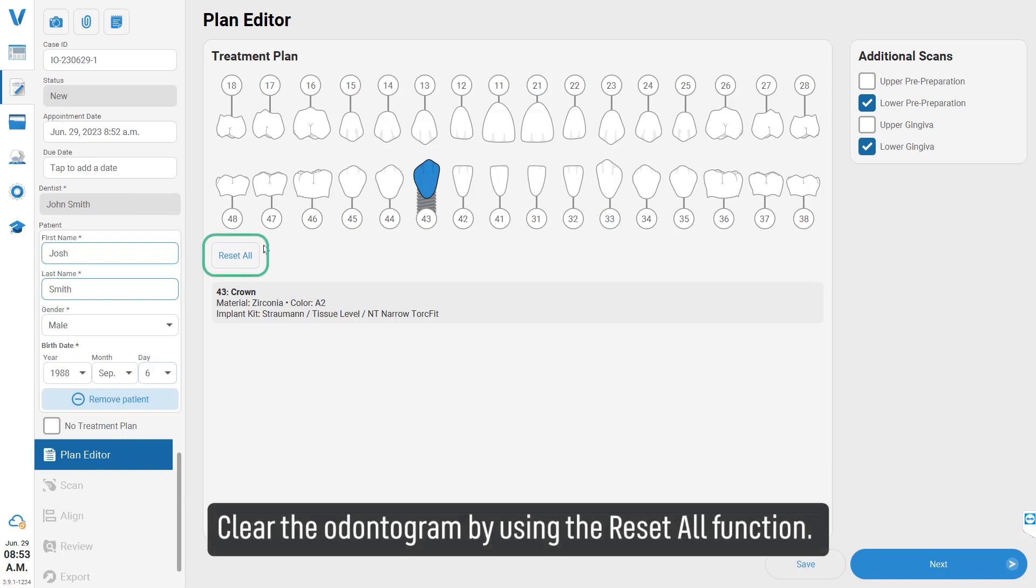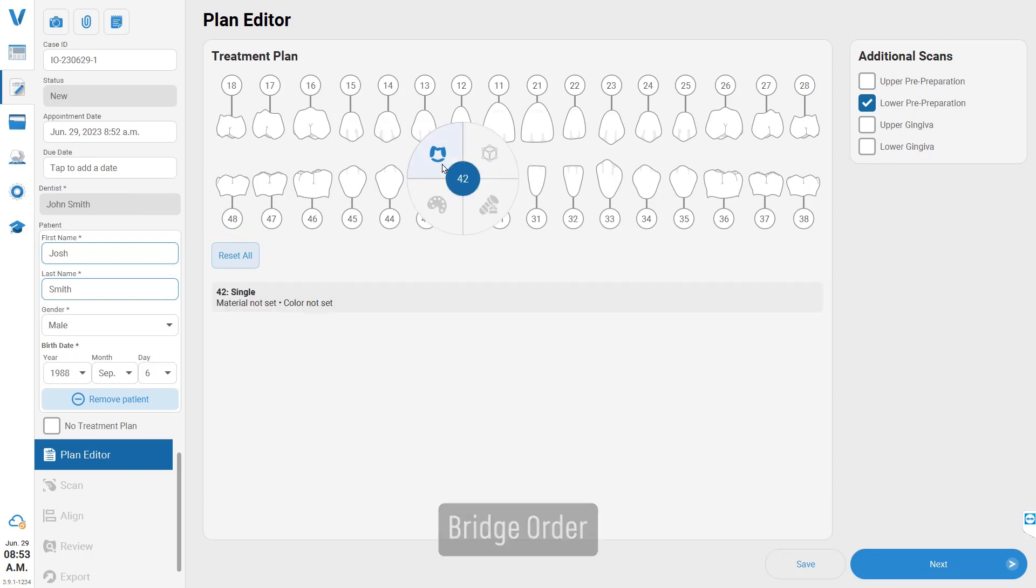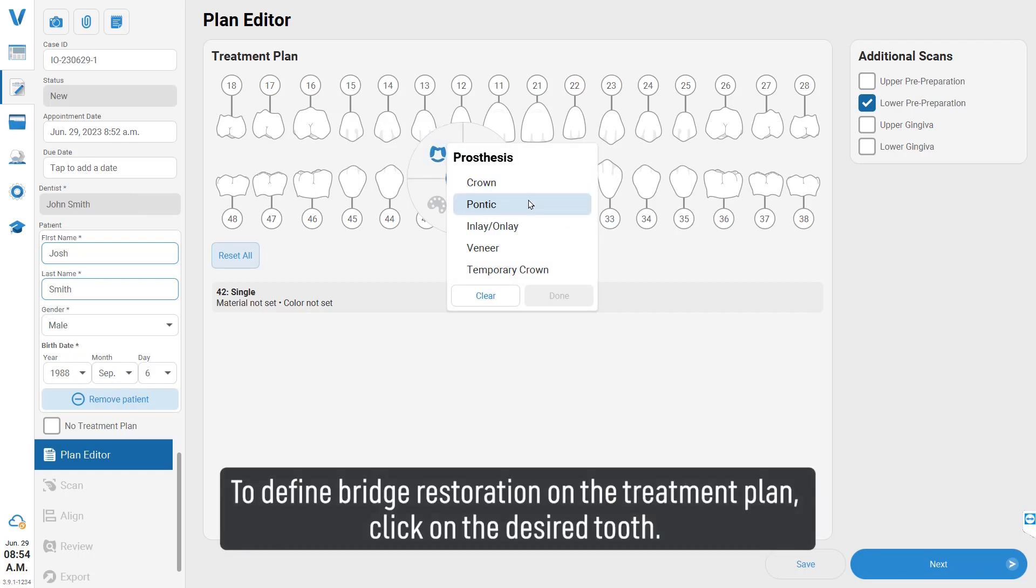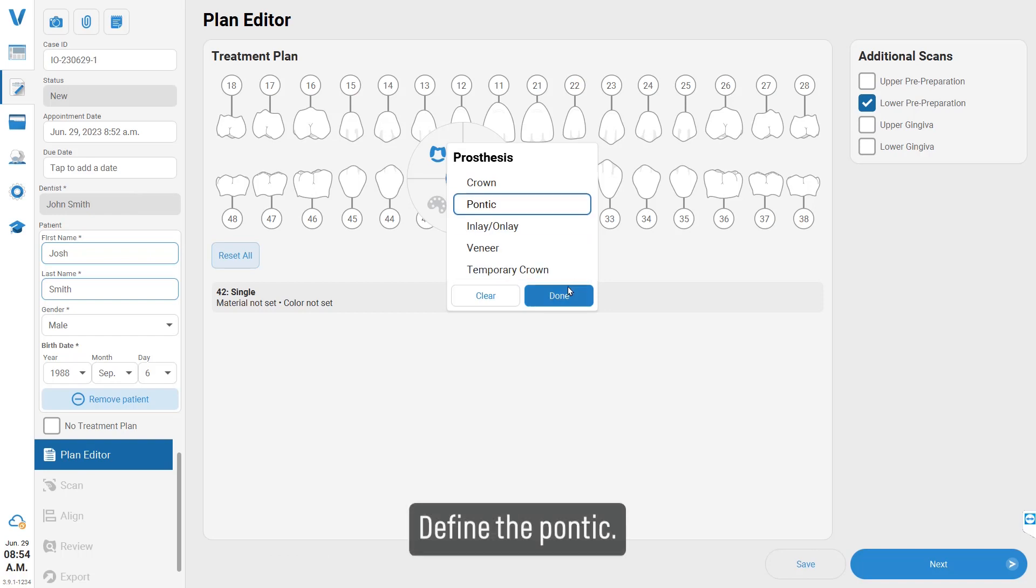Clear the odontogram by using the 'Reset All' function. Bridge Order: To define bridge restoration on the treatment plan, click on the desired tooth and define the pontic.